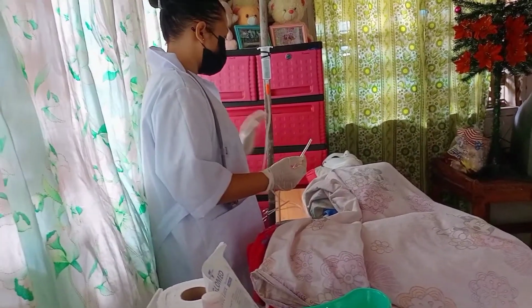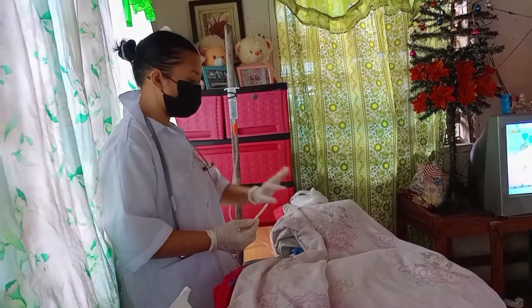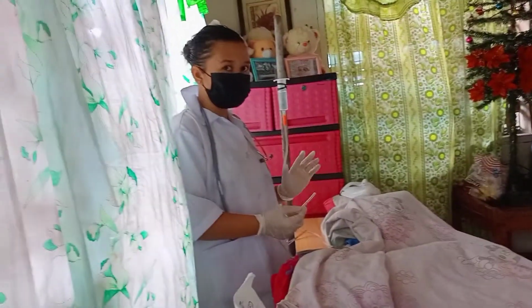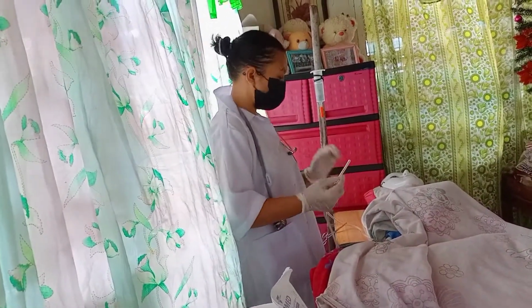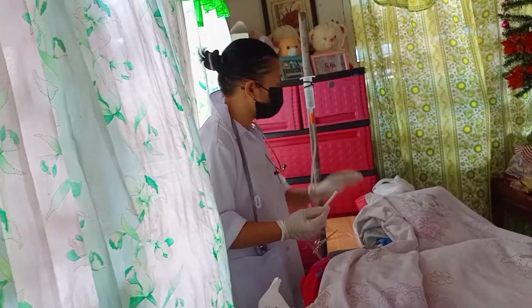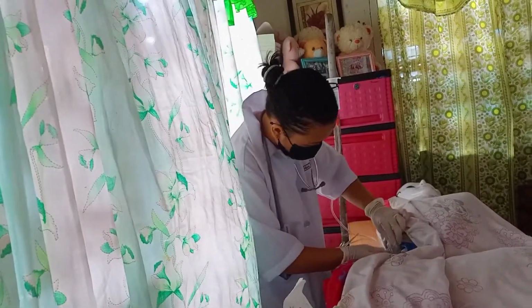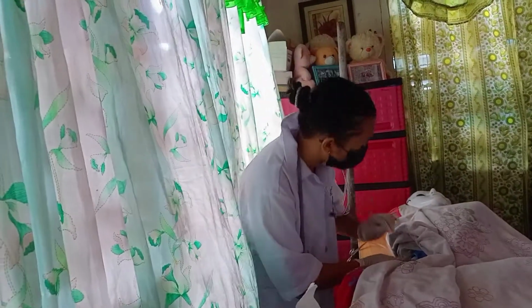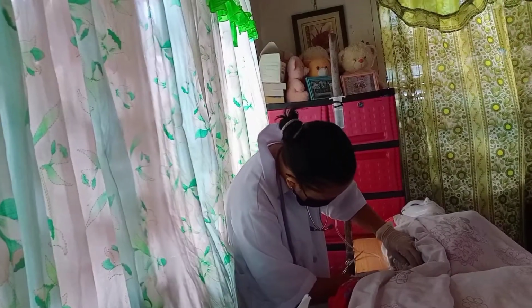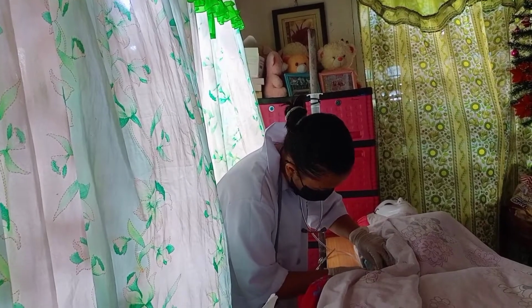So the normal contour of the rectum. Insert the tube 7 to 10 cm because the anal canal is about 2.5 to 5 cm, 1 to 2 inches long in adults. Insertion is the point to place the tip of the tube behind the anal sphincter into the rectum. So, ma'am, i-insert ko na po yung tube po, ma'am, ha? So, slowly lang po ang pag-insert ng tube.